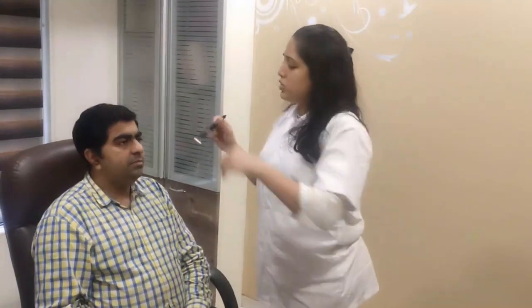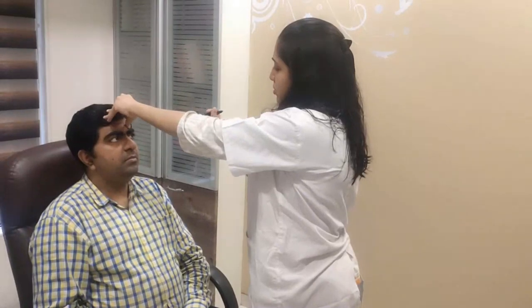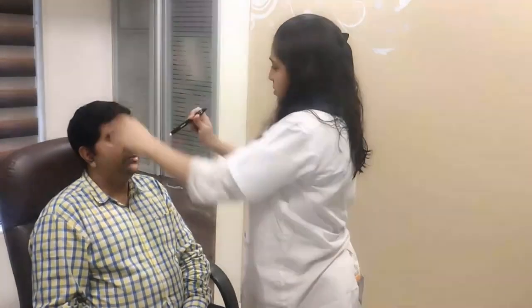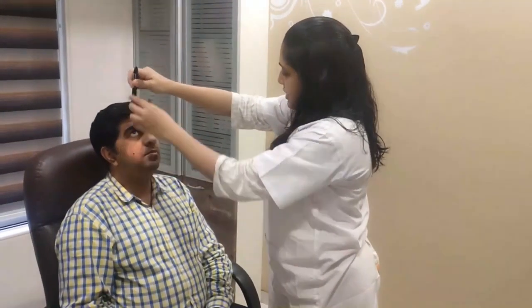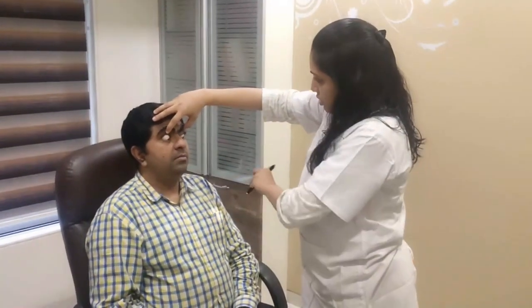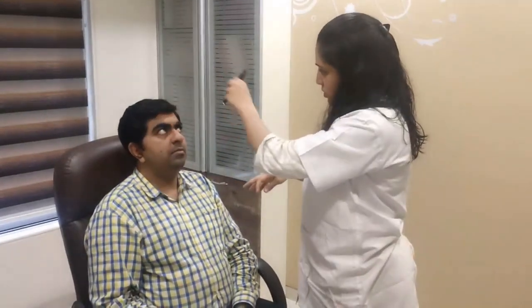Let's look at the ocular motility for distance. Please follow my torchlight. We see that the ocular motility is full, showing that the patient does not have any kind of deviations for distance. We will now do an evaluation for near. Now let's look at the deviations for near.